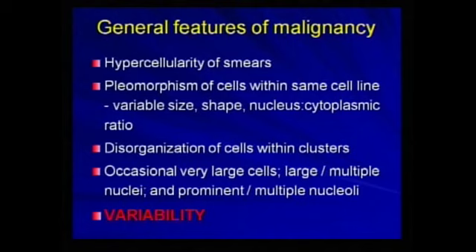One of the most confusing things in evaluating neoplasm cytology over the years for me has been to identify criteria of malignancy. And each successive textbook on cytology lists different criteria of malignancy. They list more criteria of malignancy, and the list is actually quite long.